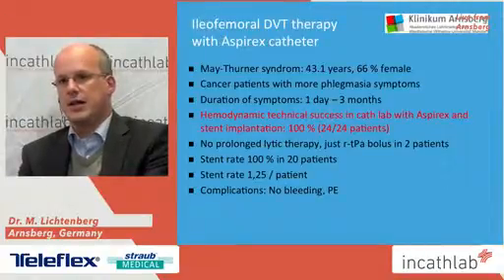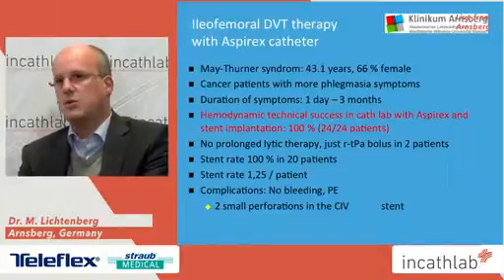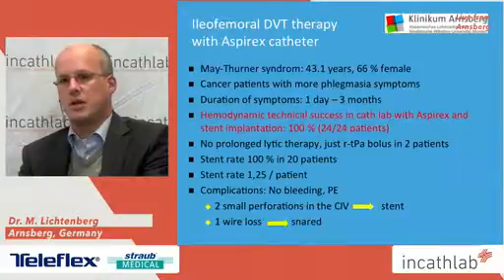We did not have severe complications like bleeding or pulmonary embolism. We had 2 small perforations in the common iliac vein, which after stent implantation were not seen any longer. And we lost 1 wire which had to be snared without complications.